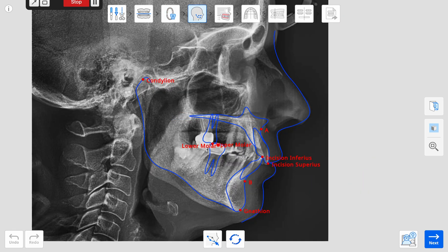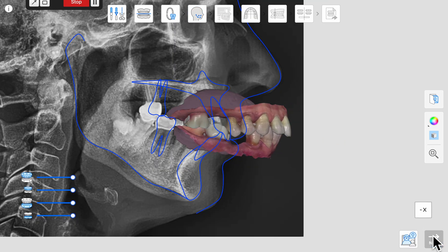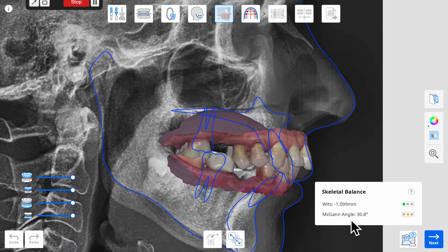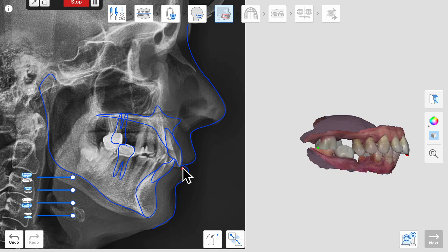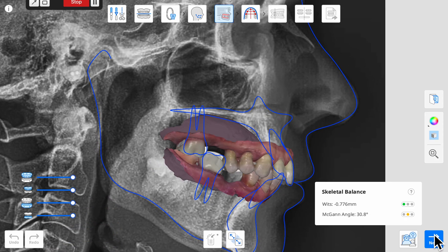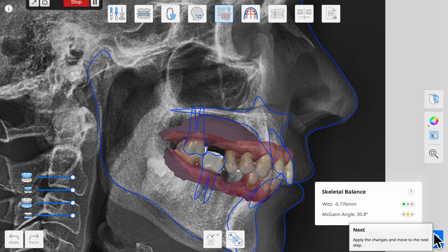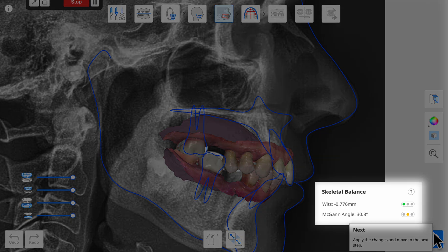If a lateral CEPH is available, it is auto-traced and the 3D digital model is calibrated and oriented onto the 2D x-ray, giving an instant traffic light indication of any problems in the skeletal relationship.